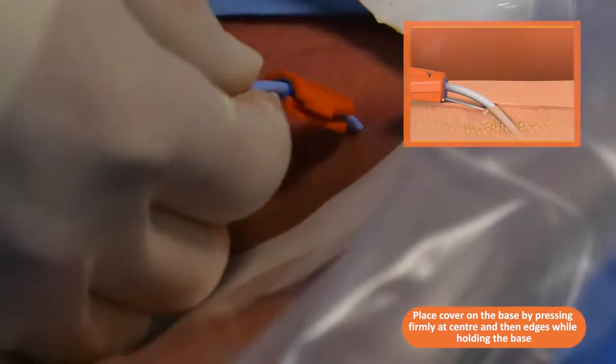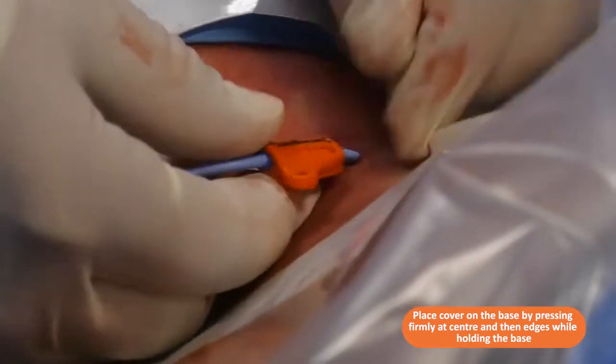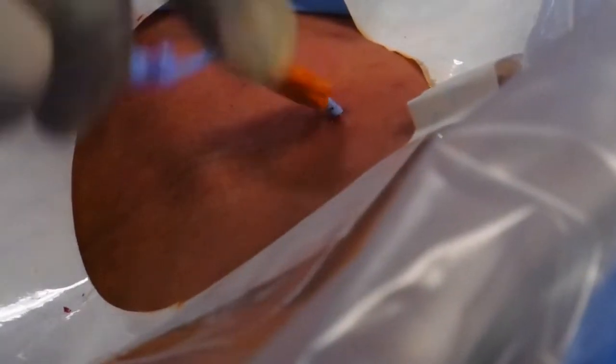We're going to set that to 15 and a half. Now we can clip the lid of the Secura calf. It's really important that you make sure it's fully bonded down with no gaps — you can see there was a little gap there; we hadn't quite squished it down properly. There we go — now it's clipped in and you can see there are no gaps around the Secura calf, securing it very nicely to the patient's skin.